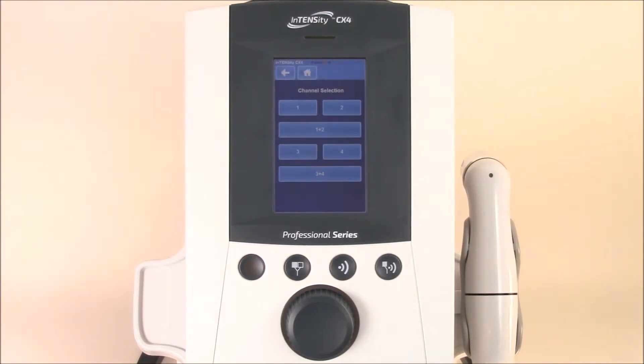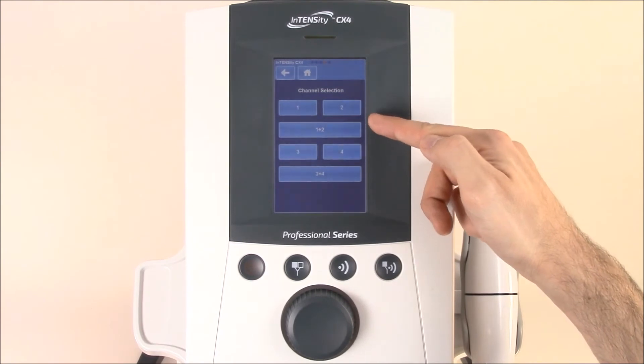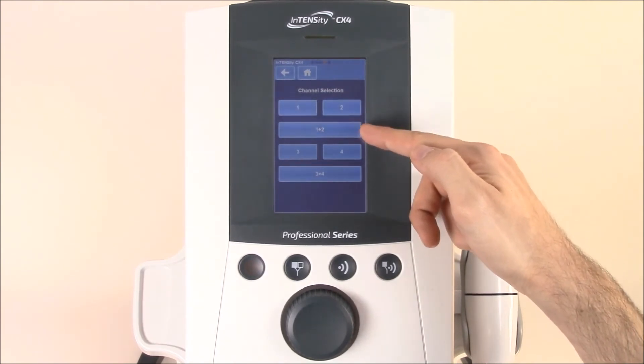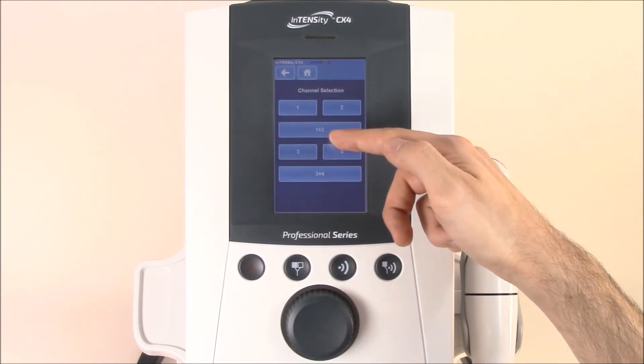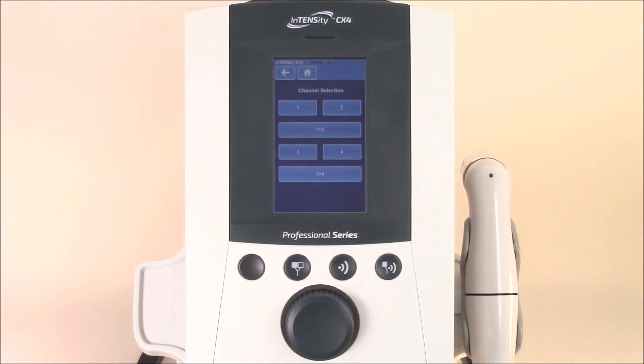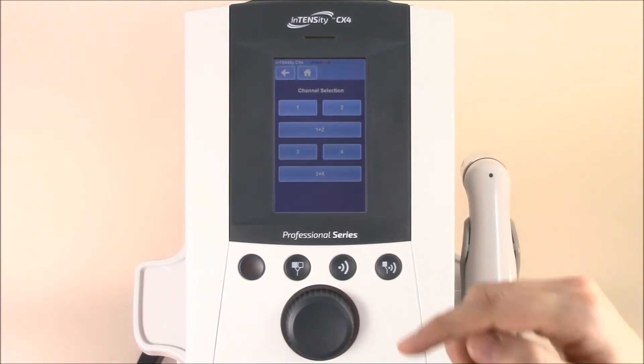You'll see that you get a channel selection as well. You can use channel one or two if you're using just two electrodes, or use channel one and two together if you're using four electrodes. You can do the same thing for channels three and four, and then three and four together. For demonstration purposes, we'll use channel one and two.